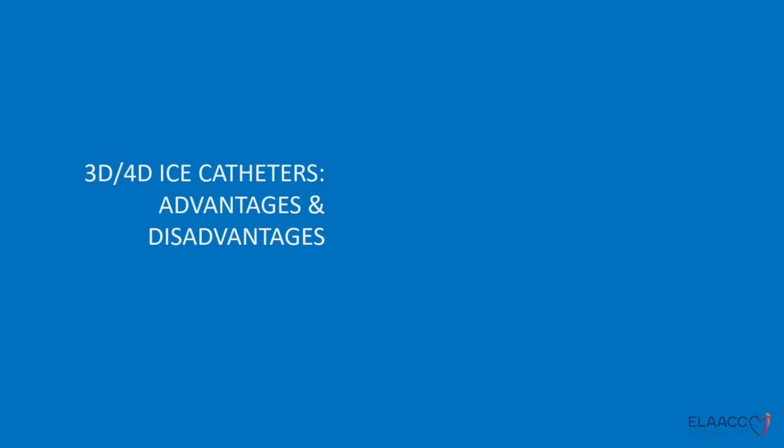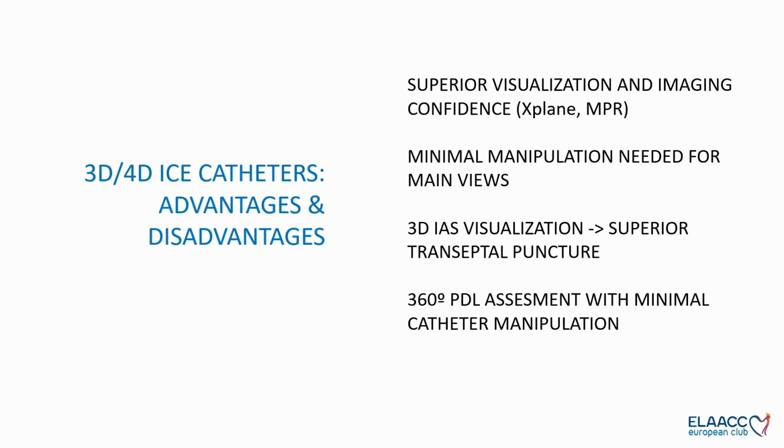After that, we have seen the image quality of the 3D and 4D ICE catheters. Sergio has shown us that this type of catheter, of course, has superior visualization and imaging compared to 2D imaging. Also, what is nice is that minimal manipulation is needed.